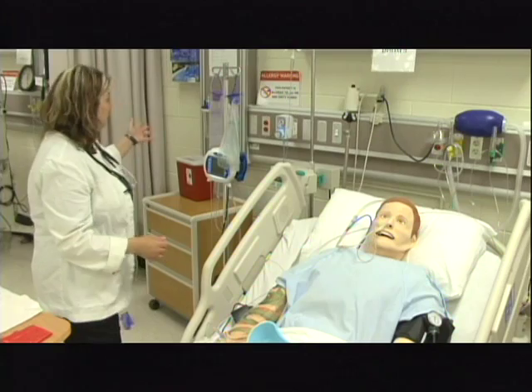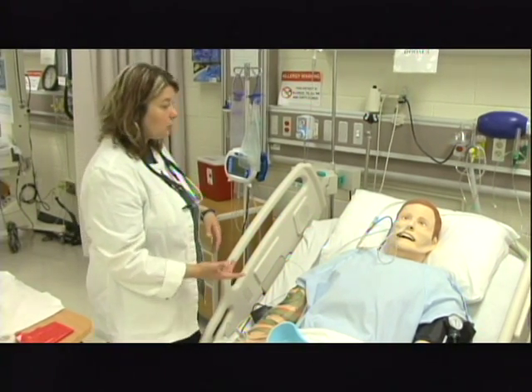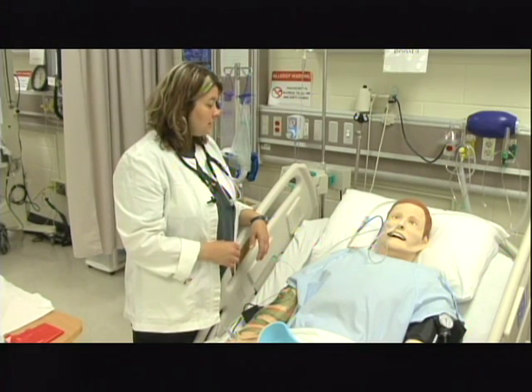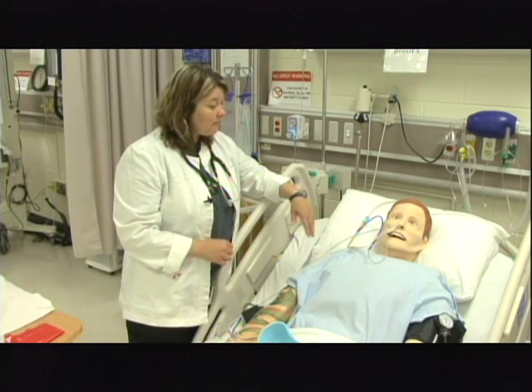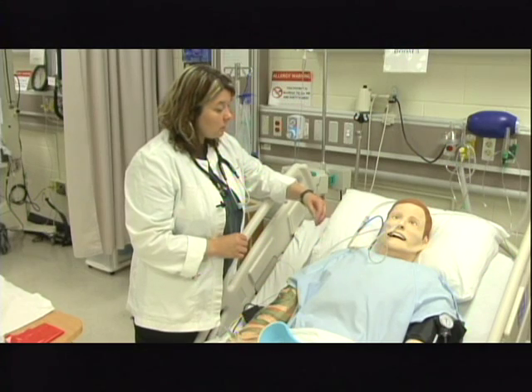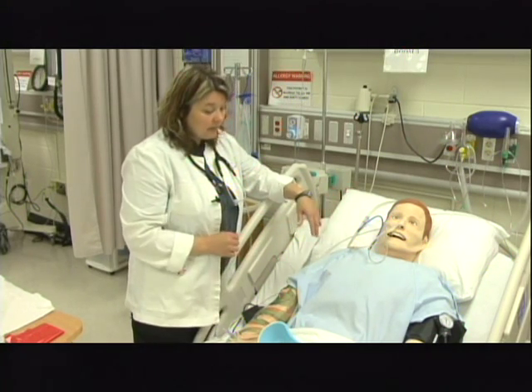Whenever I did look at the suction, he has a lot less secretions or no secretions over here, so his clinical picture is consistent with the doctor's order for the actual discontinuing of the tube. So I'm going to go ahead and take this out, and it's probably only going to take me 5 to 10 minutes to get it done. It may well be a little bit uncomfortable because, of course, the tube has been in there for a little bit, and it will irritate your throat as it's coming up.